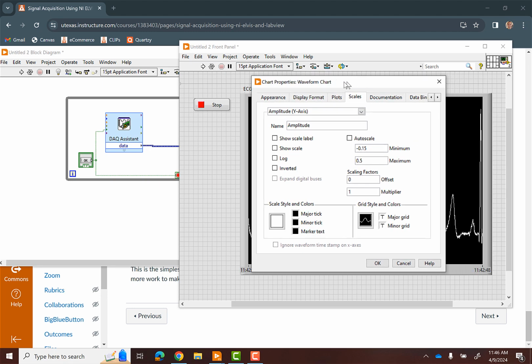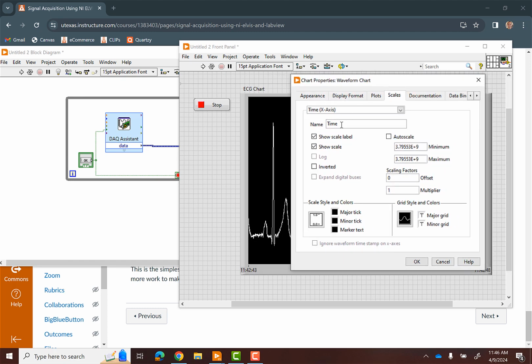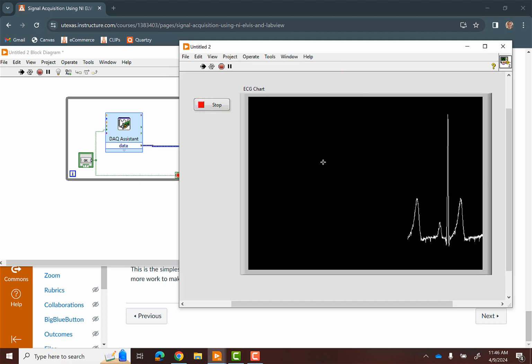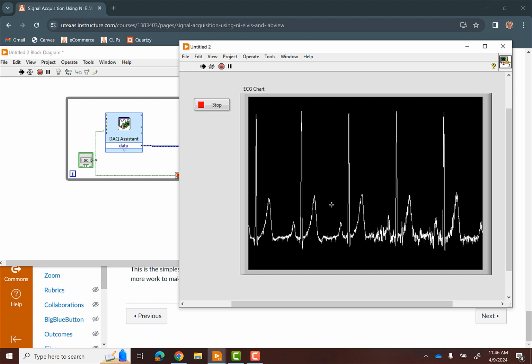That looks better. We could do the same thing on the x-axis. We can get rid of the graph and the numbers if we wanted. Might as well. The one thing you'll see happened is it dropped down below that. So I'm going to hit OK. You can actually resize this thing so it doesn't look so ugly, right? So it looks like that. So now go ahead and run. Still works about the same, but the Y is not going to be bouncing around because it's not going to be auto-scaling.